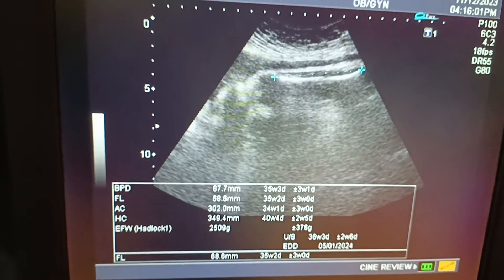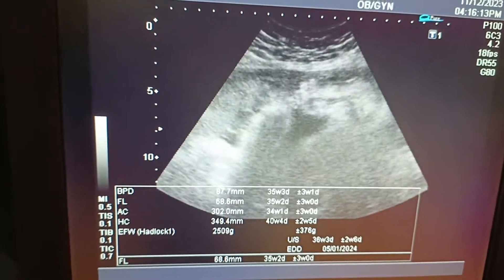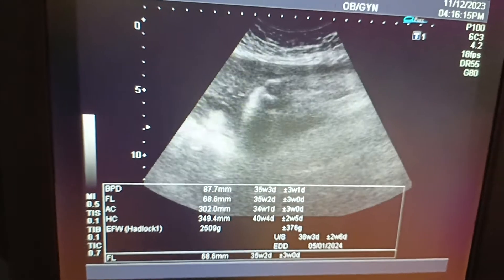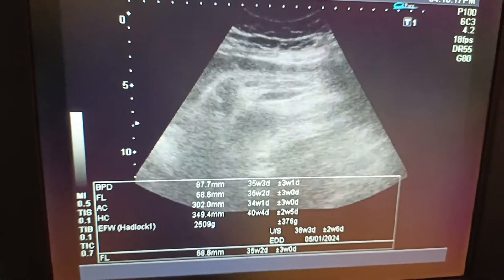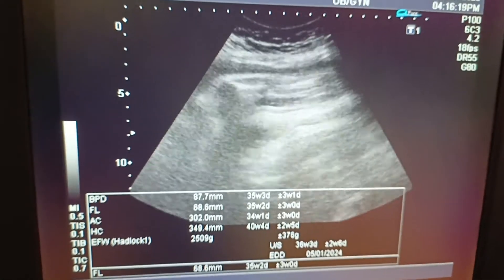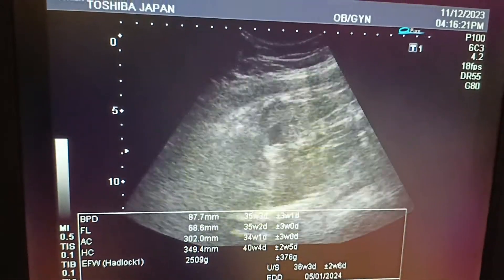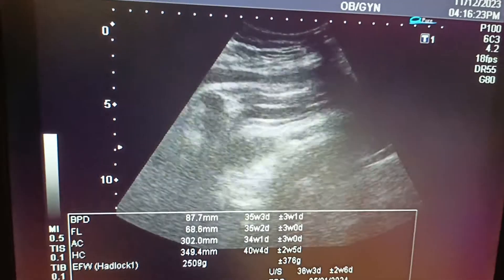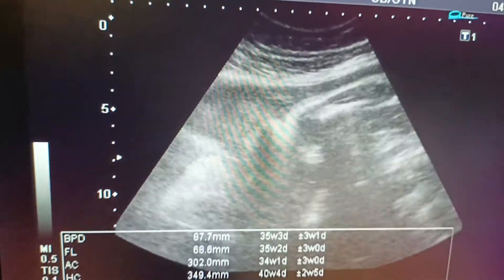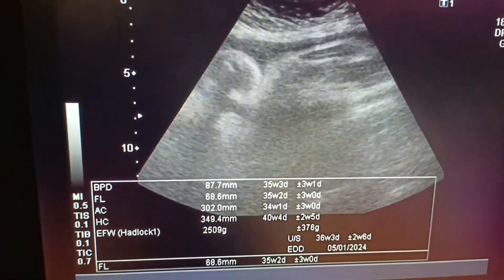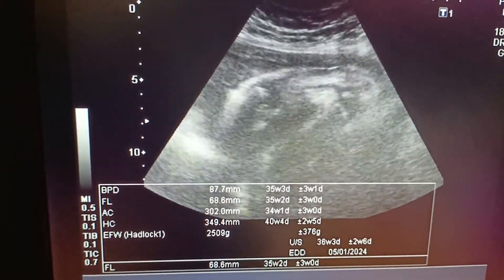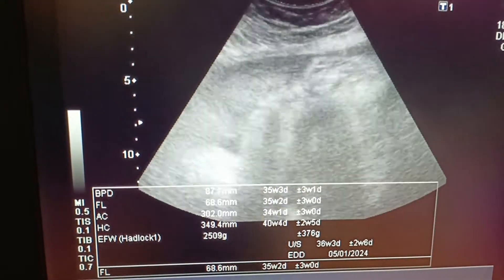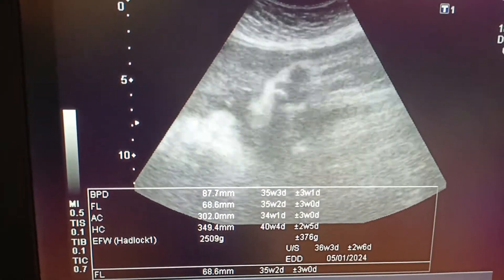The gender is male. This is a breech baby, and in a breech baby it is difficult to see the gender, but it is very clear in this case. You can appreciate that the gender is male.